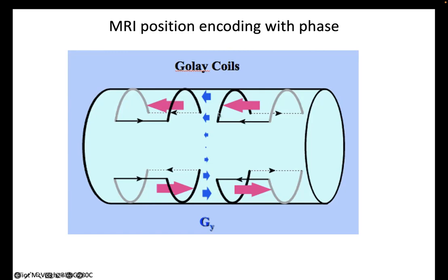Similarly, over here, the current is going through like this. Same right-hand rule, I have a magnetic field going around in this direction. And so at this point, I have an additive magnetic field in this direction, right, when I add those two up. I pulse the current such that down here, the current is going through this way.